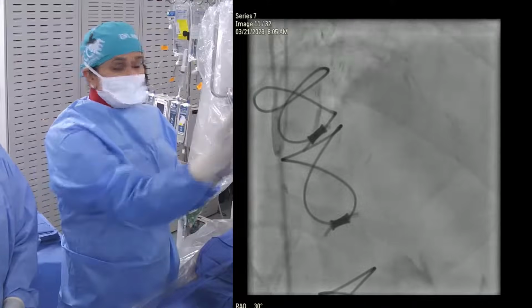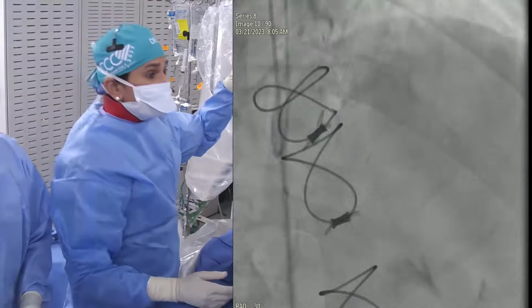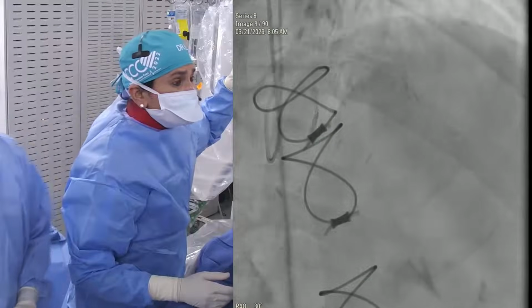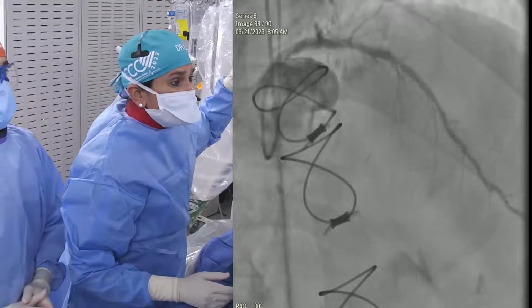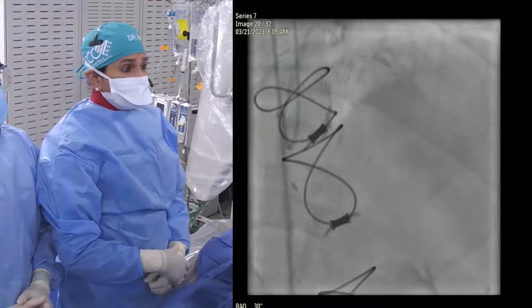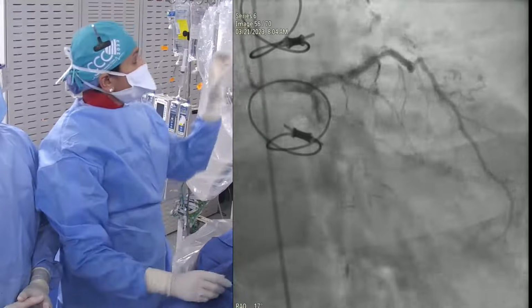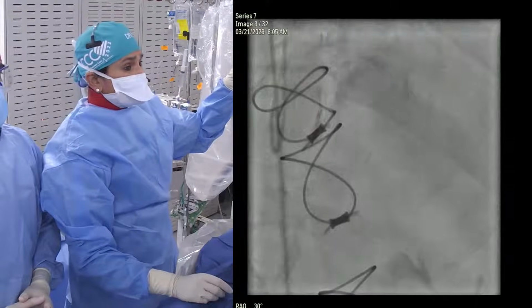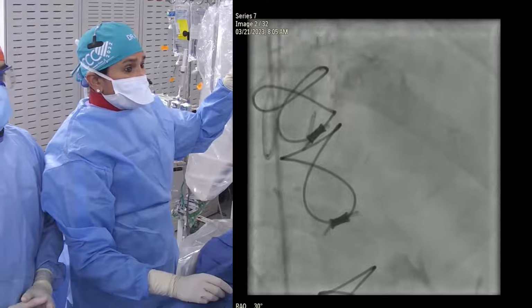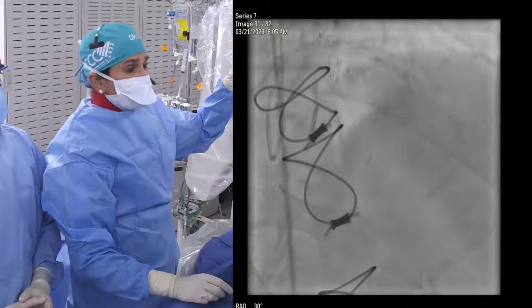You can see it very well, but on angiogram it doesn't even look stenosed. Just look at that area. Actually, it looks quite narrowed here in the caudal view. Maybe we can show that double layer, or what we call carinal diaphragm. When the carina gets endothelized, you always see a white shadow, which somehow in this view you don't see.